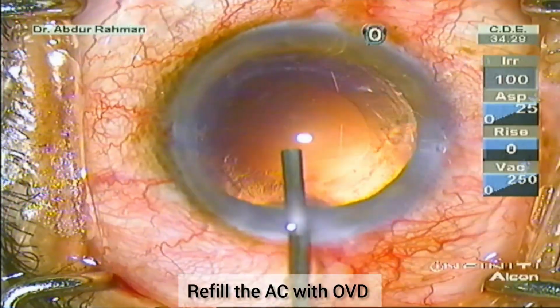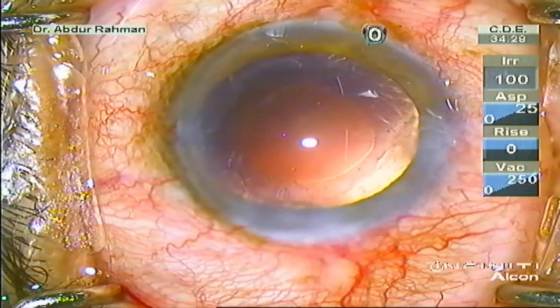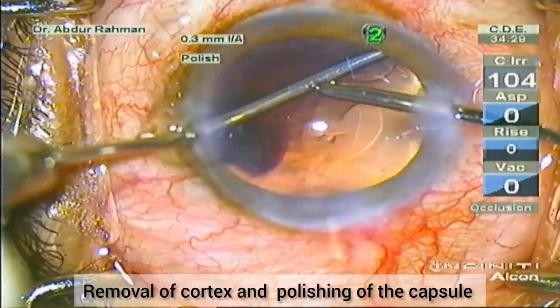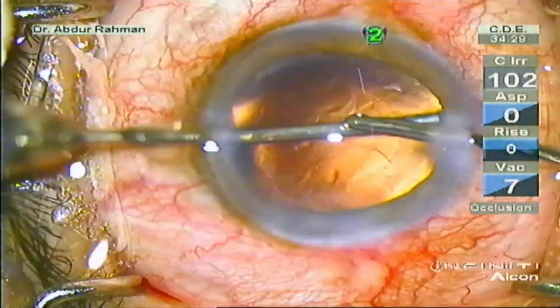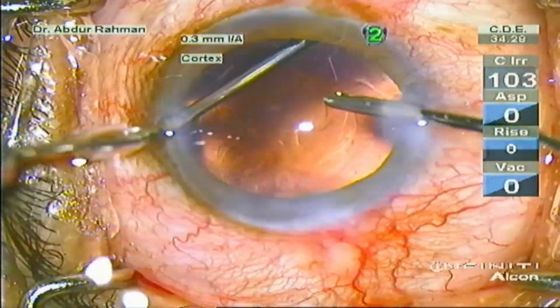Now refill the AC with OVD and commence with the cortical cleanup with the bimanual IA handpiece. During cortical cleanup, you can also perform polish of the capsule.